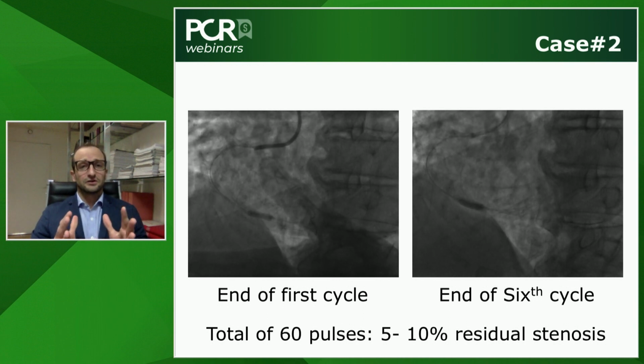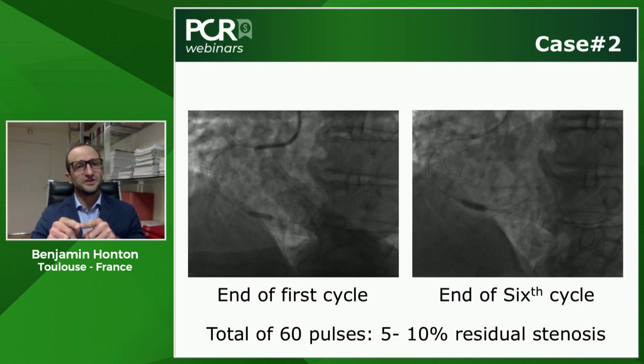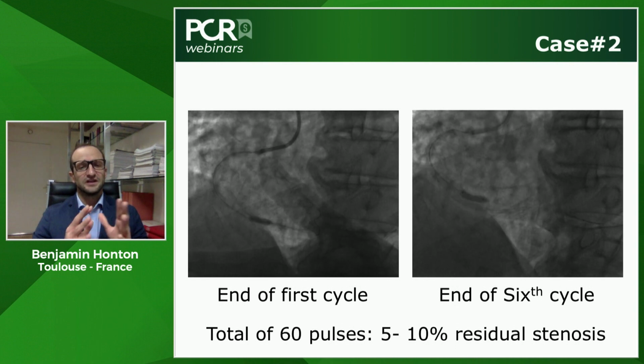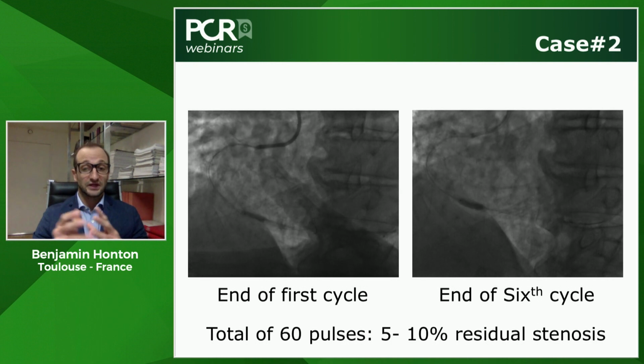No, quite surprisingly, I didn't have any friction despite the tortuosity and the calcification on the mid-RCA. One important tip and trick is that you have to avoid twisting of the buddy wire to improve the deliverability of the catheter. You know that the crossing profile of the IVL catheter is nearly 0.042 inch. But you can see in this particularly challenging anatomy that with a simple buddy wire technique, you have quite easy delivery of the catheter. That's indeed a nice demonstration.